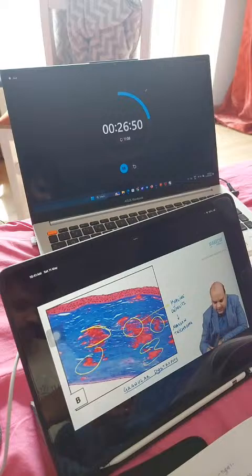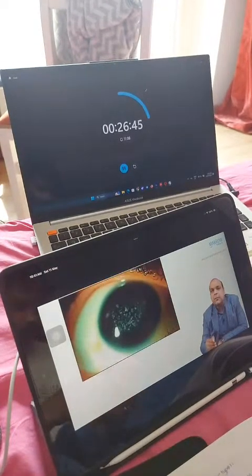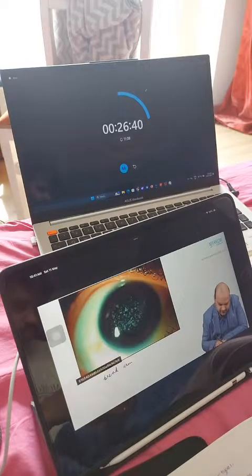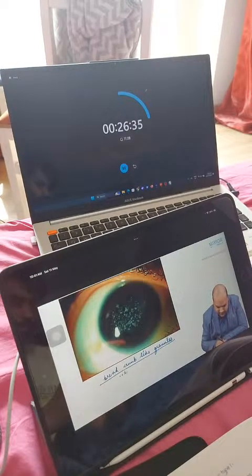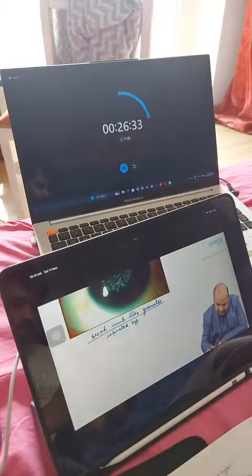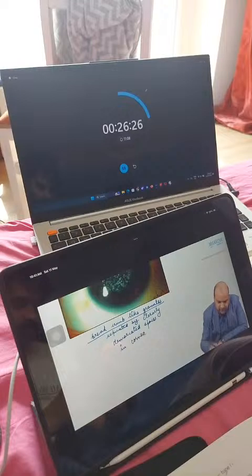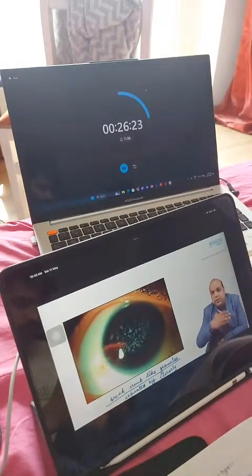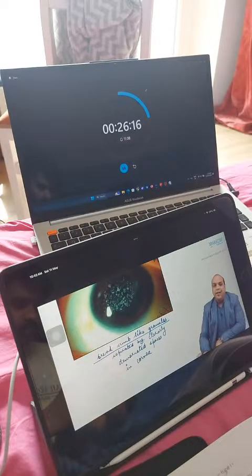No problem. Now we are saying granular dystrophy, granules. So what is the appearance like? It is a very easily discernible dystrophy on slit lamp. We are able to see breadcrumb-like granules which are separated by clearly demarcated spaces in the cornea. You will see as if breadcrumbs are deposited throughout the cornea and the intervening spaces are absolutely clear. This is a characteristic photograph of granules on the cornea, granular corneal dystrophy.